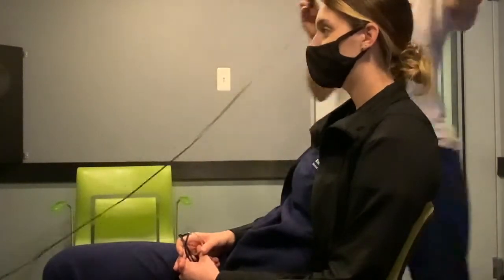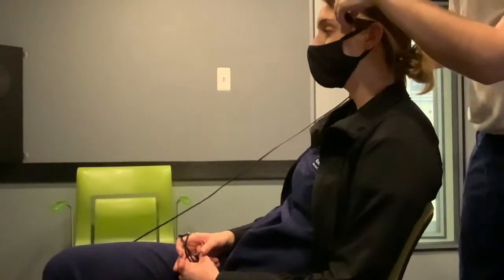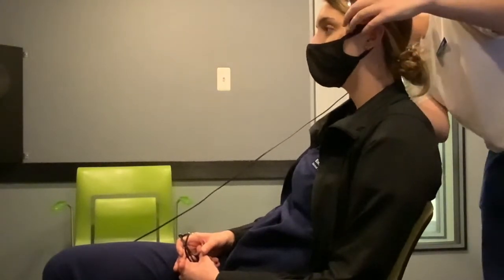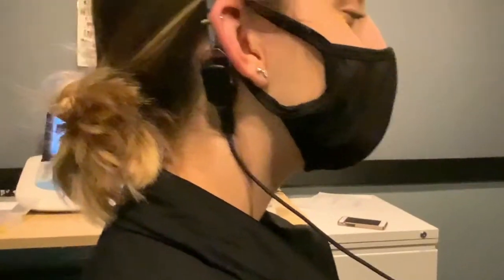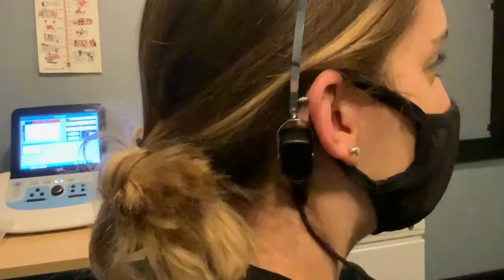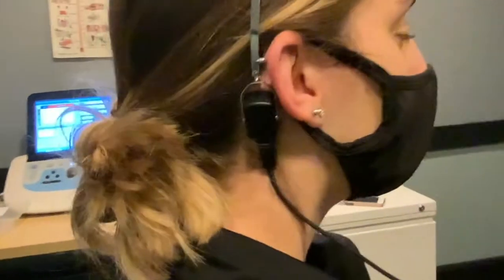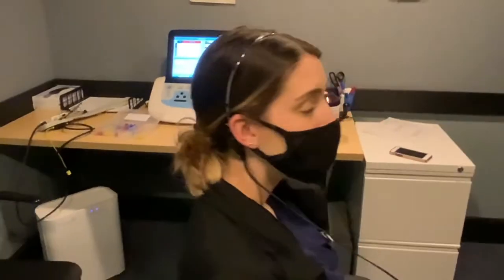So I'm going to place it over your head with this part resting about on your temple, and this part going right behind the ear. Let me give you a visual. So we'll come around and I'll show you. Here it is, right behind the ear. If anything, it can probably be moved up a bit because we want it right on that bone. We don't want it pushing up against the ear or making it so that anything is squished or out of place. But that looks pretty good. How does it feel? Does it feel like it's slipping? Feels great. All right, awesome.